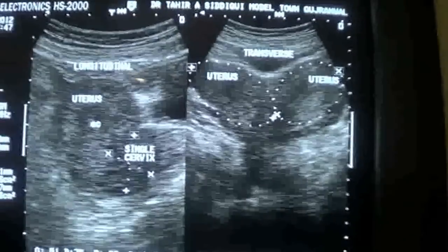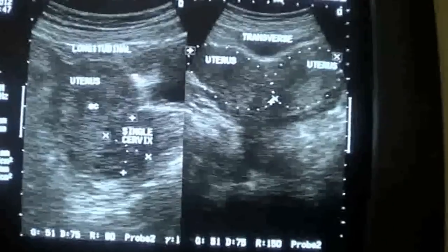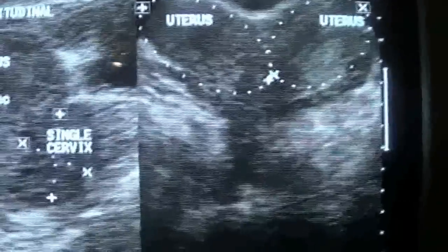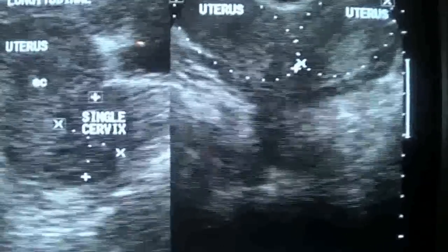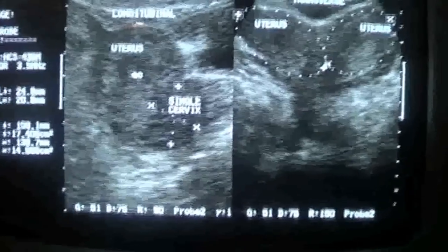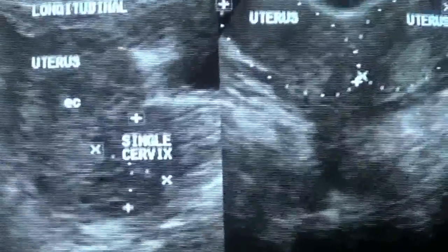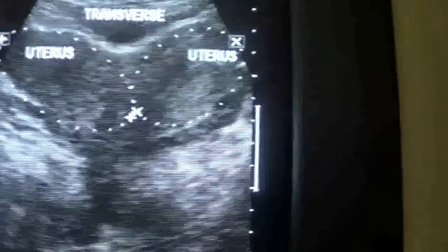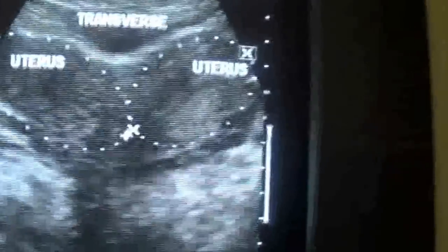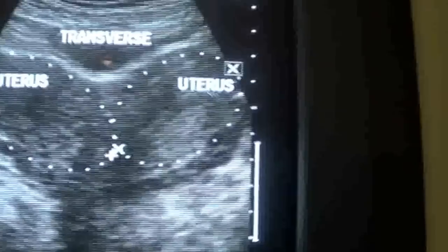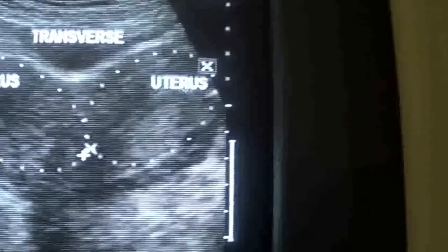On the right side of the screen you can see the uterus with a single cervix measuring 24.8 millimeters by 20.8 millimeters with normal dimensions. On the left side of the screen, the uterus shows an anomaly in that it is enlarged in width and has two endometrial canals within it.